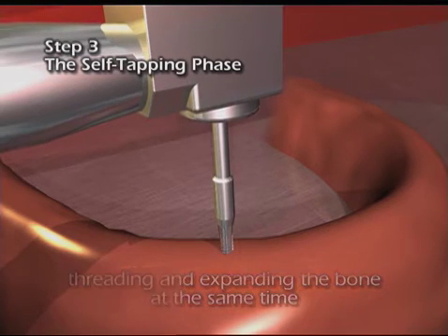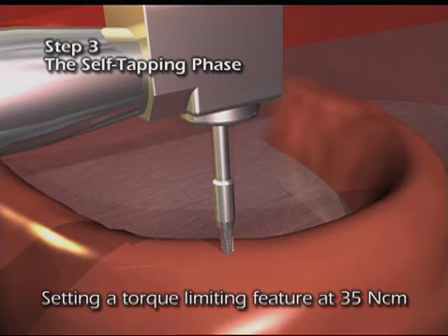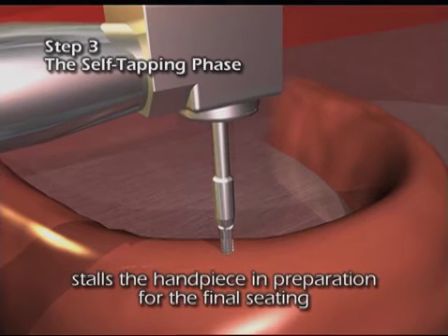A recommended option of setting a torque limiting feature at 35 newton centimeters stalls the handpiece in preparation for final seating.